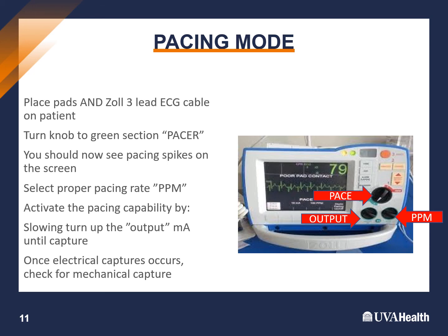So your ECG is going to look a little different once he goes back to his intrinsic rate, if he's able to do that. So just note that if the ECG starts to change and looks a little different, if the rate is higher than what your pace beats per minute is, that's his intrinsic rate, and it may look very different. It should look very different than his pacing rhythm.